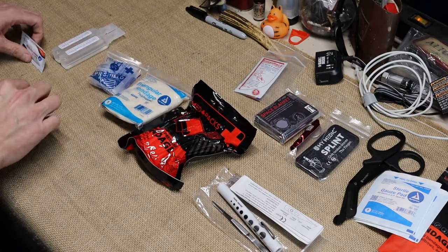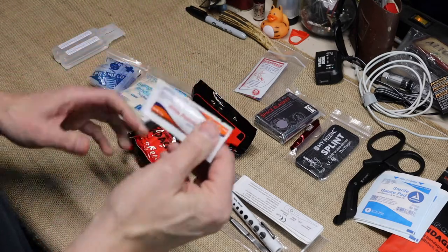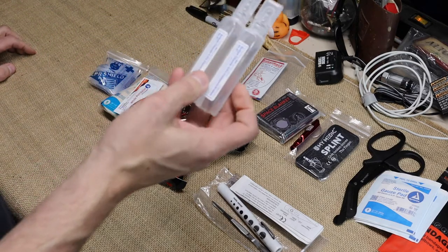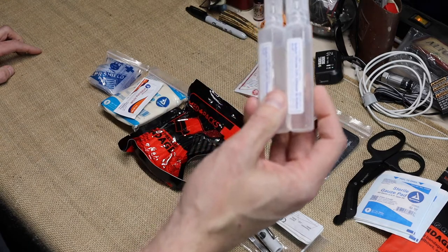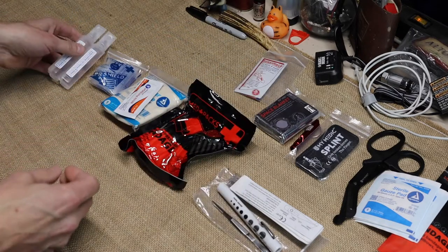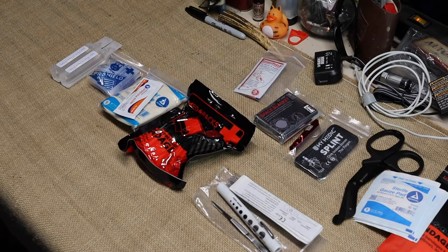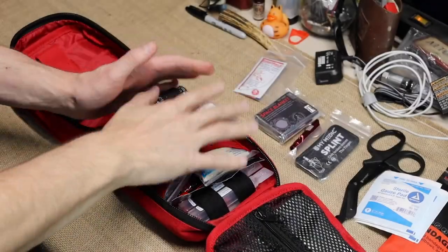There's white petroleum in case you need it, and here's something I thought was really cool — sodium chloride, basically wound wash. If you have a wound you need to wash out quickly, you have something to do that with. That's your middle section.